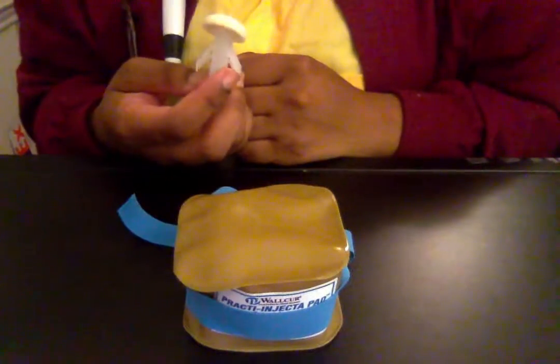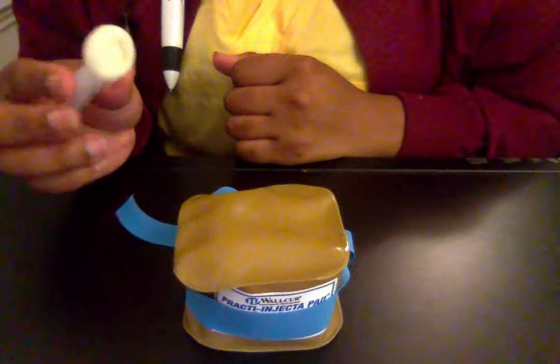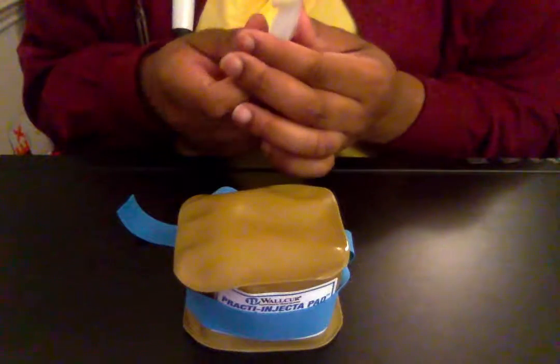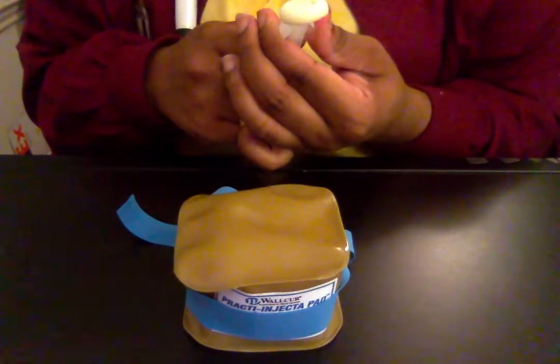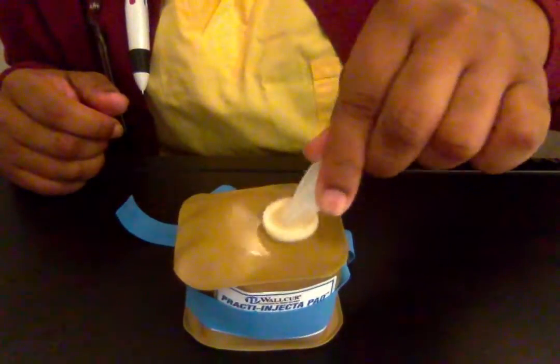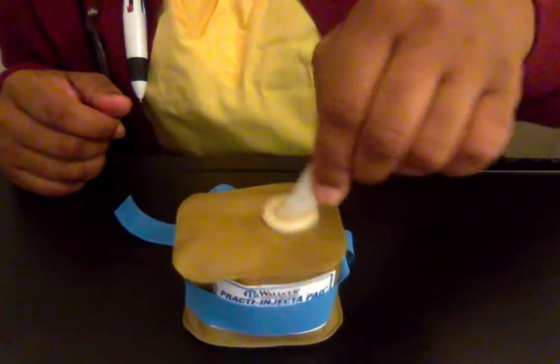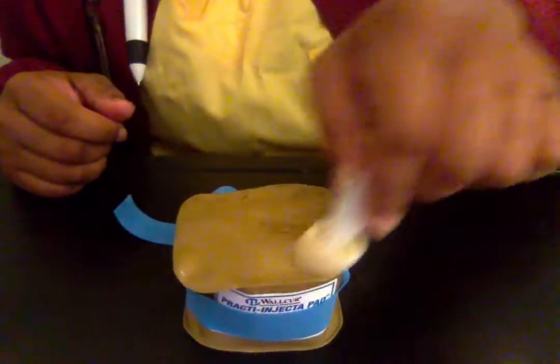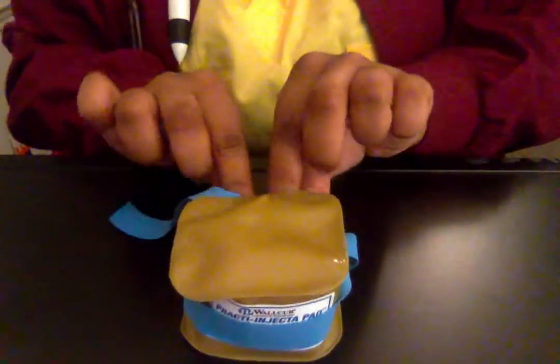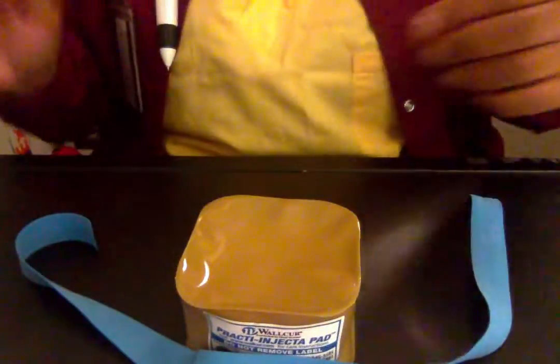So now at this point in time, the alcohol would be dry by now. And so since I found that, I would take my chlorhexidine. I would go ahead and break it. So now that that's broken, I'm just going to go in an inner to outer motion with it. Okay. And now that we've got that clean, I'm going to discard that. And then at that point, I'm going to have to let it air dry. So I'm going to take off my tourniquet, let my patient breathe a little bit. I'm going to be talking to them.